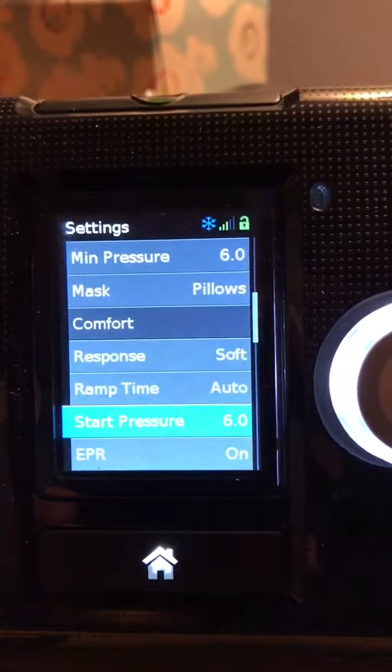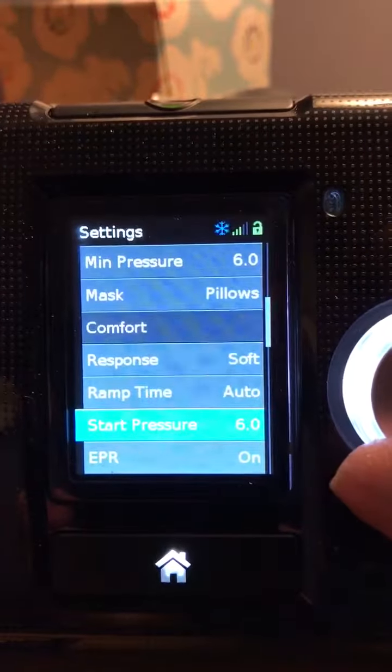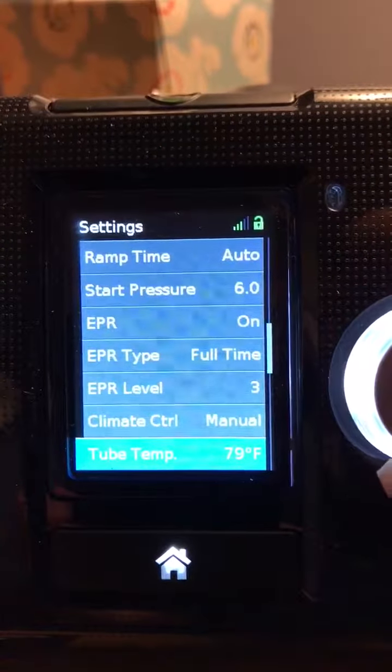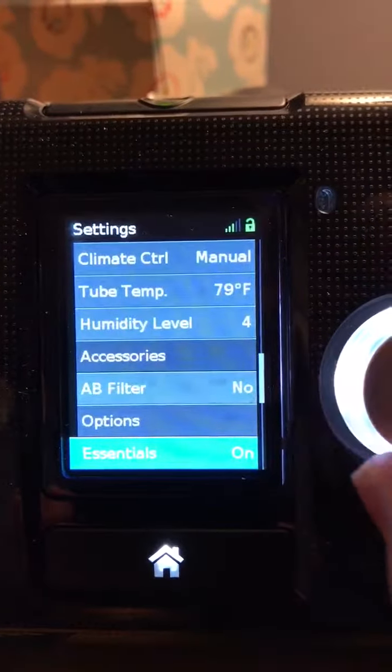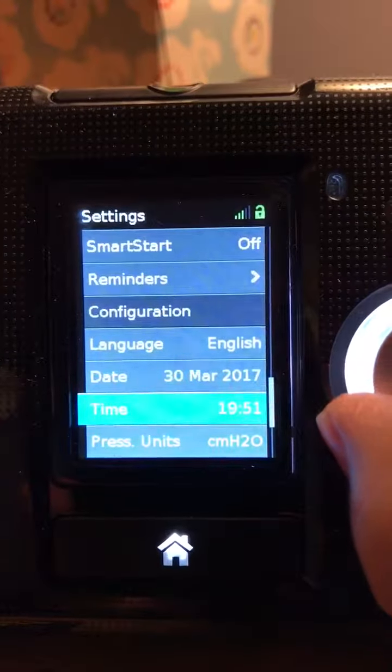Also, the same as you did the minimum pressure, set it to 6. But as you go down, this is all probably what they set at the store. I just left everything else alone.